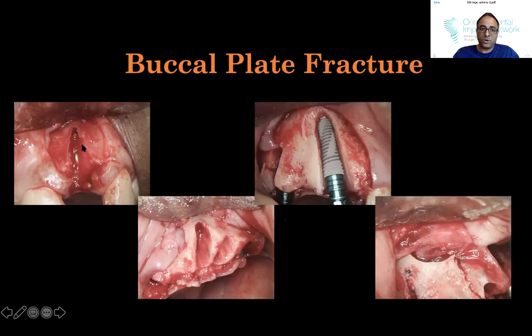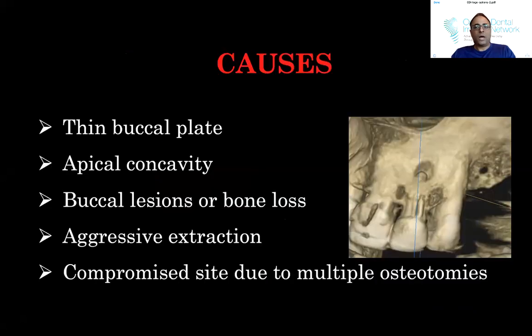This is an anterior zone on the left. This is a canine area where, again, an immediate implant was placed. And then the lower right case is an actual huge, massive fracture right from the nasal spine over to the premolar region. And again, I'll get to that. That was a fun case of an all-on case.